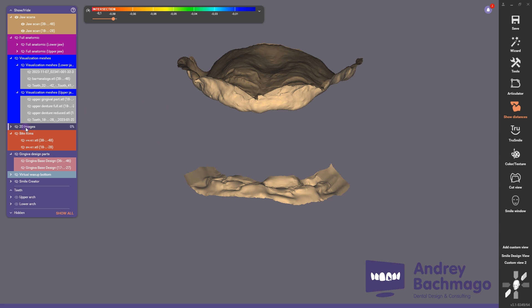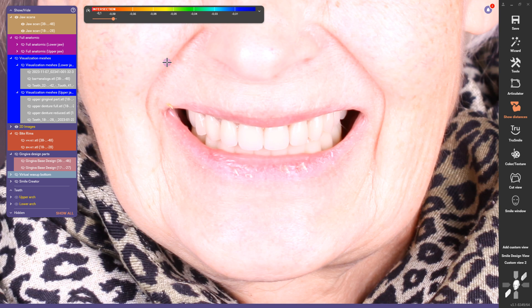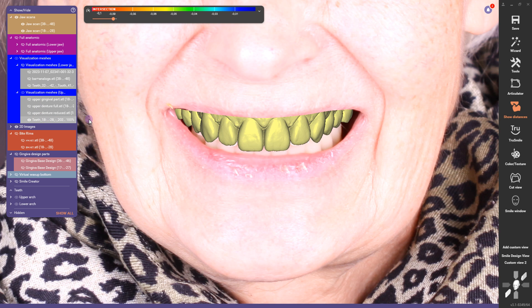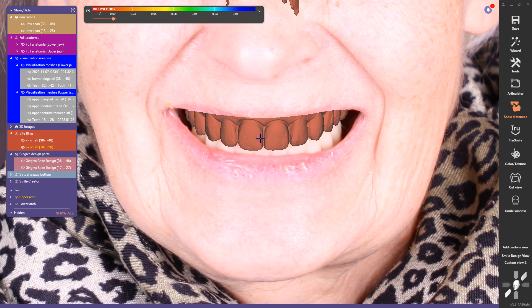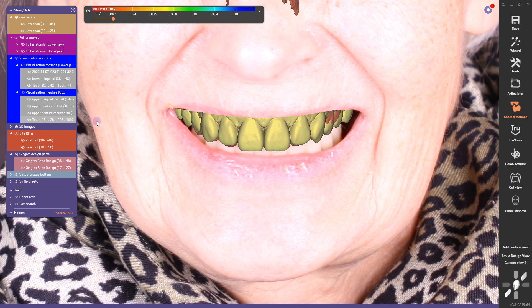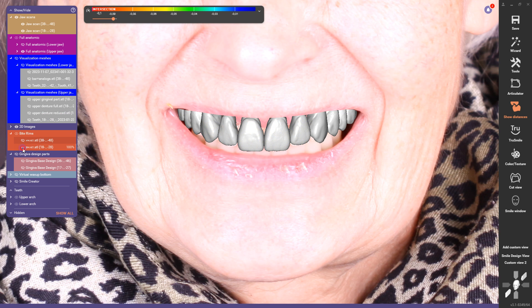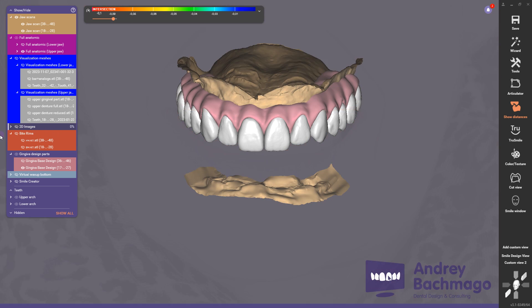First we need to check what new aesthetics we can create for this patient. I used a donator scan — I think it looks well suited to the denture — and I used it to make a copy for the anterior area teeth. For the posterior area I followed the aesthetics and also prepared the gingival area. This is how it looks.